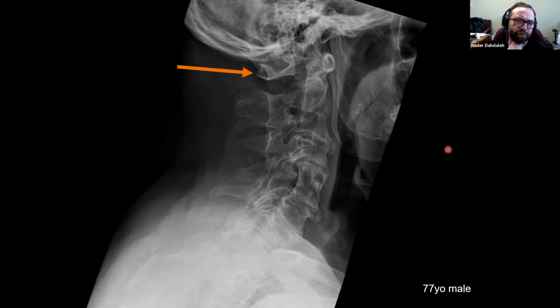Yeah, before we move forward, Alex. So I agree with Dr. Goodwin. He has congenital autofusion of C2, C3, and I think C5-6 are autofused as well. So this qualifies as a Klippel-Feil. I'm not sure if even the C1 is fused to the occiput as well. So multiple long lever arms, making adjacent segment disease plausible.